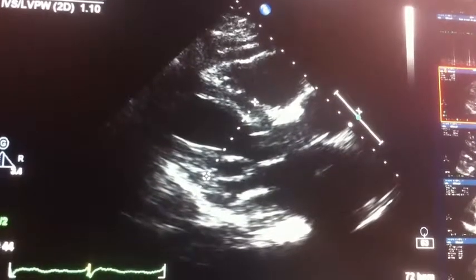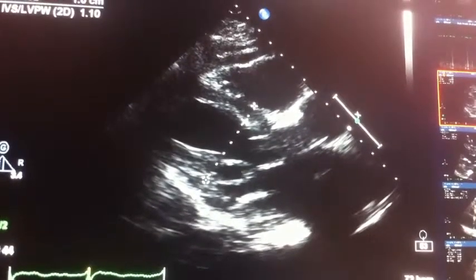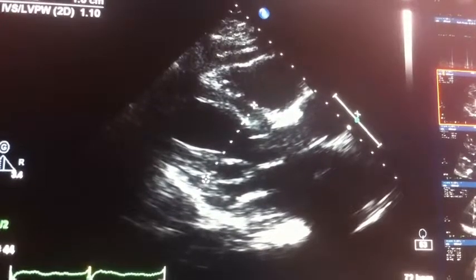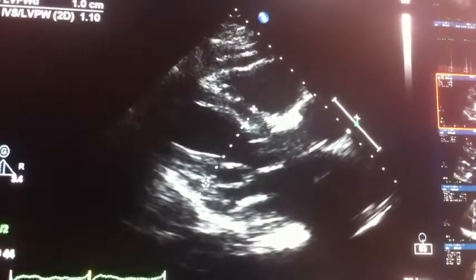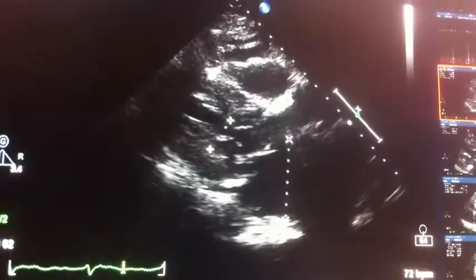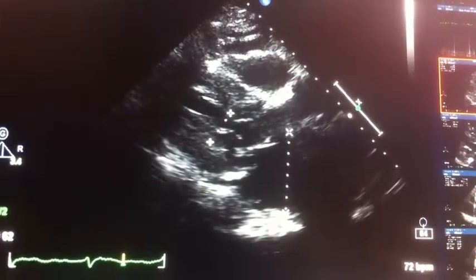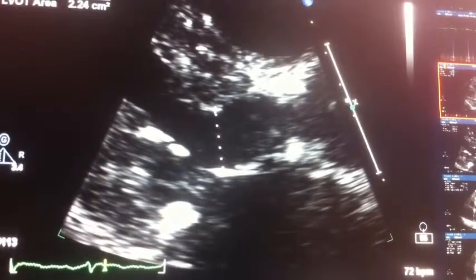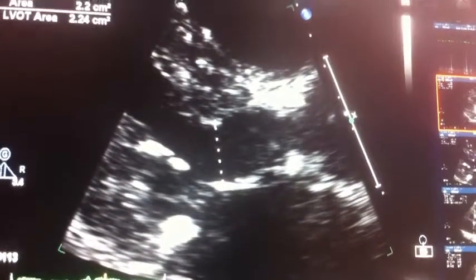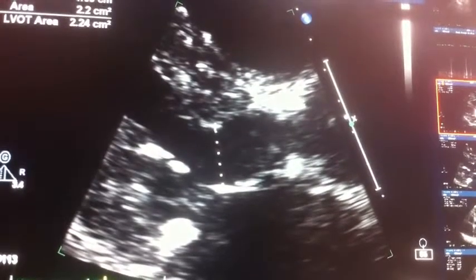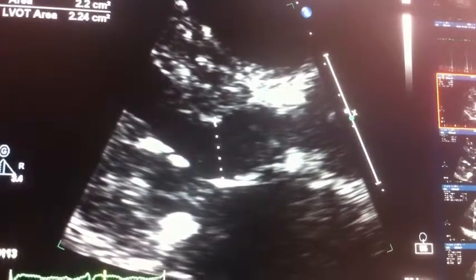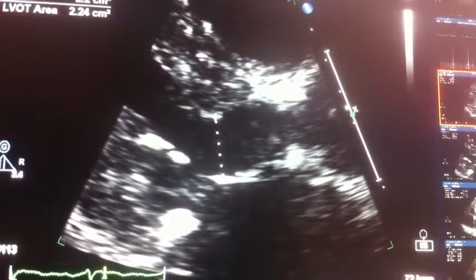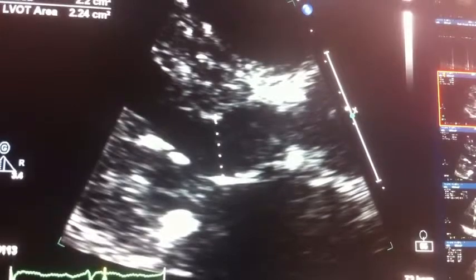For the last thing, I'm going to take you through this patient's study that I actually measured — these are the still frame images. Here are the wall thicknesses and chamber sizes we talked about before: that's diastole, and this is systole. This is a measurement of the LVOT that we'll use for the continuity equation, which allows us to calculate the aortic valve area. We measure this and then two other Doppler profiles to calculate the area.